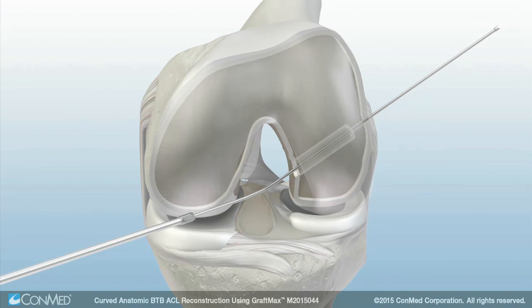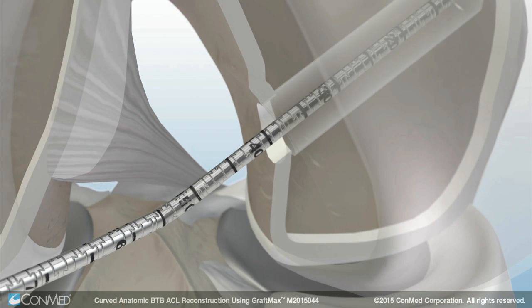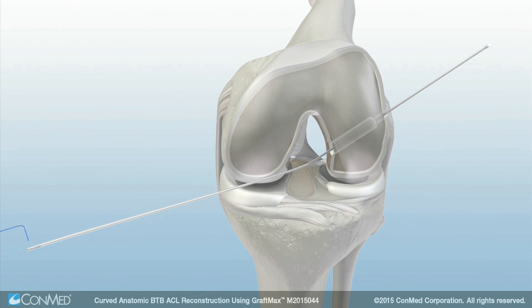Advance the FlexSentinel to ream the femoral socket. Remove the FlexSentinel from the joint. Then advance the GraftMax Flex channel reamer through the lateral cortex. Remove the Flex channel reamer, leaving the FlexExact pin to be used to position a passing suture.